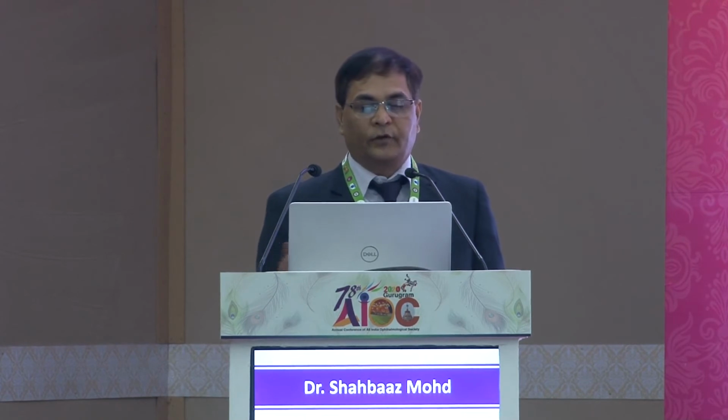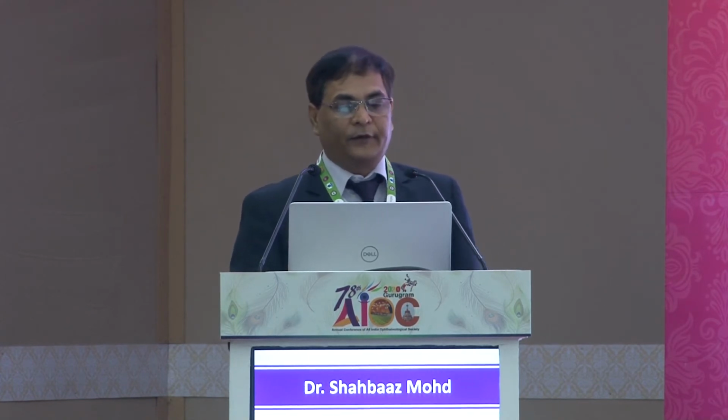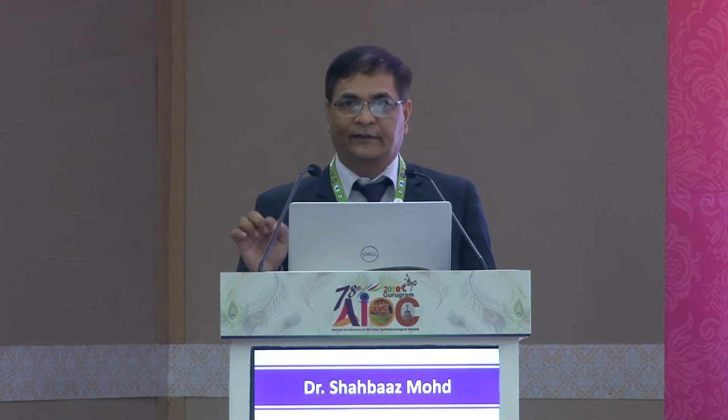So always measure both eyes. A difference of 0.3 between the two eyes should always make you suspect an error and re-measure. Some errors happen when you give the spike; in this figure you can see this spike is smaller. That means the beam is not passing through the center of the lens, so the posterior spike has become smaller.